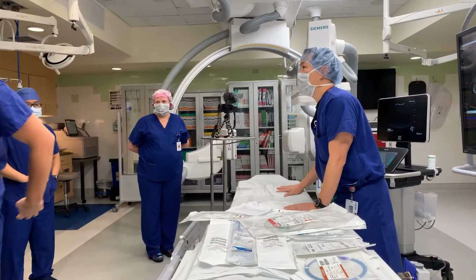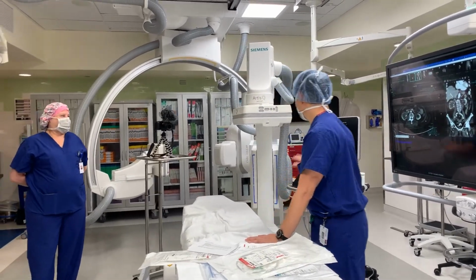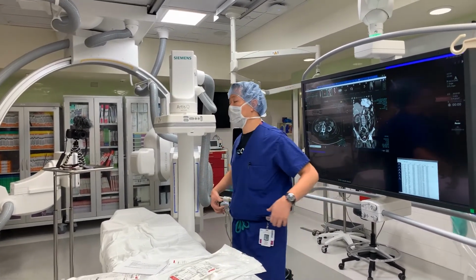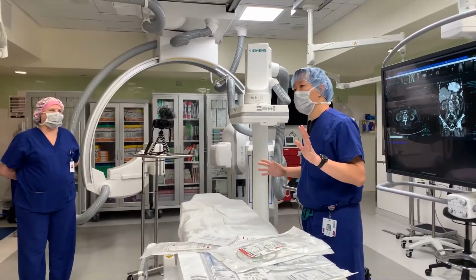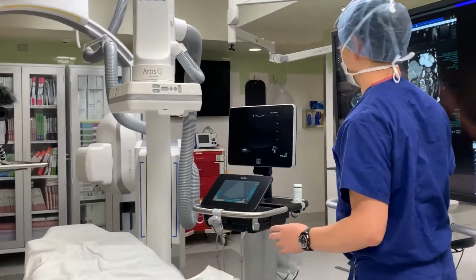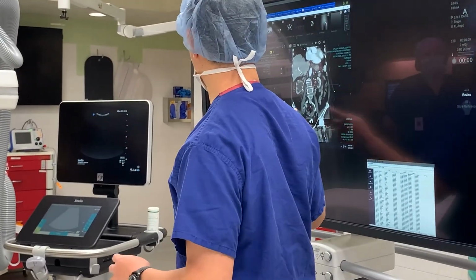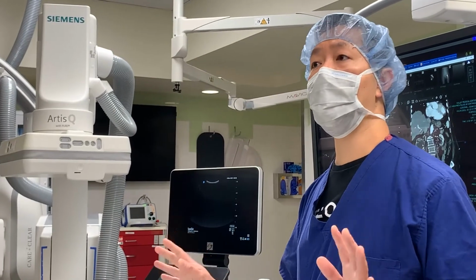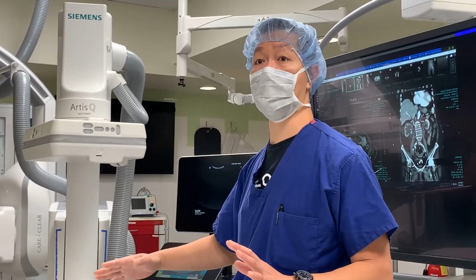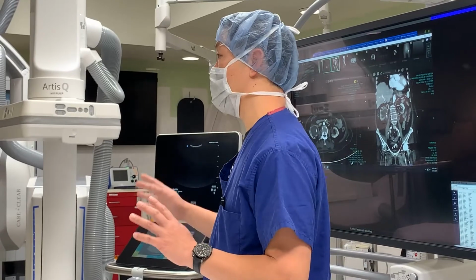So, positioning. The ideal position for perc nephs is prone. The reason for that has many reasons. First of all, it's easier to see on ultrasound because almost all perc nephs come from lateral to medial. If somebody is lying on their side, sometimes that's doable, sometimes it's not. The other problem is that when you start imaging, oftentimes the kidney does not look normal. When you poke something and you're not sure if you're in, and you start injecting contrast, if you don't get something that looks like a kidney, you might not be in the kidney. And you won't know unless you can get a true AP picture. If somebody's lying on their side, now you're rotating this whole thing 90 degrees just to see the kidney. That's why it's so difficult. People have placed perc nephs into the wrong organ before, which is why I'm pretty adamant about prone imaging.